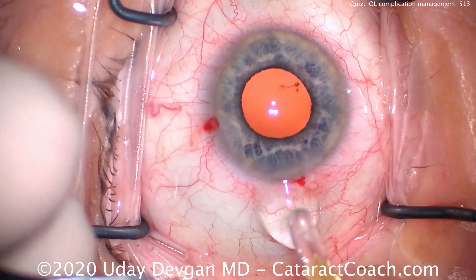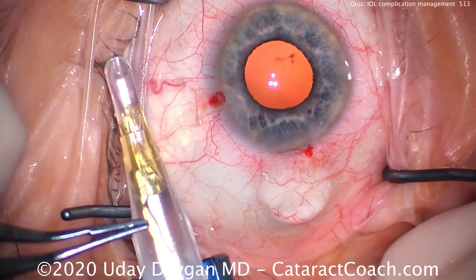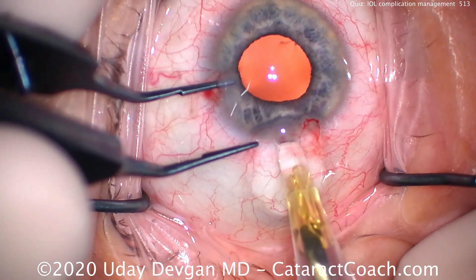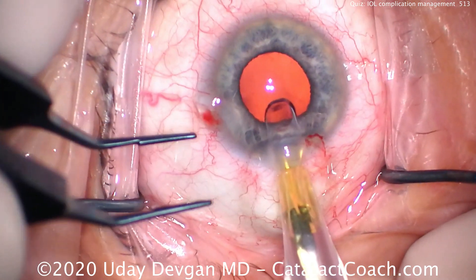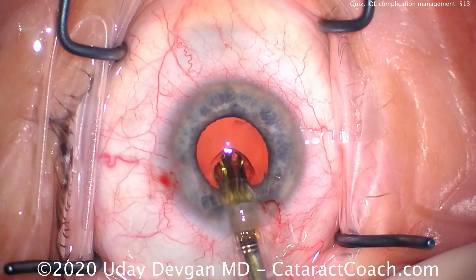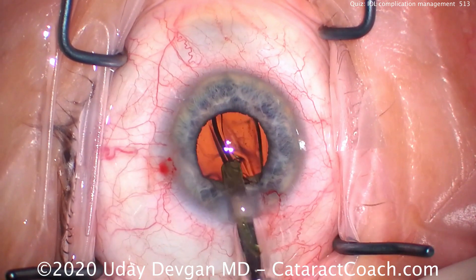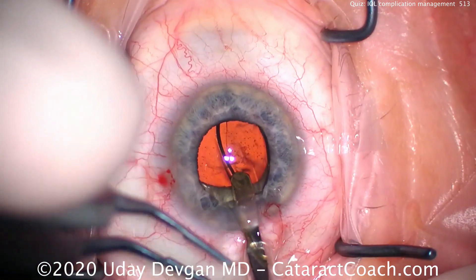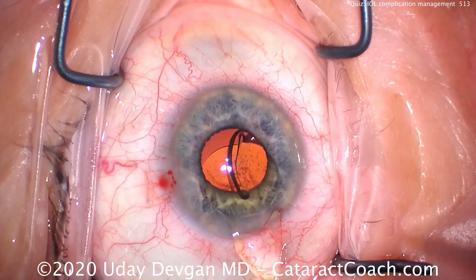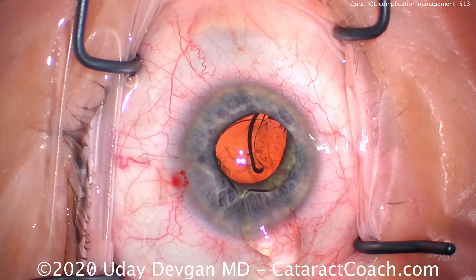We're going to zoom in and put the lens in. What instrument am I going to use to hold the paracentesis — the chopper as usual? No — I see that haptic right there, so I'm using forceps just to quickly hold here. I want the forceps ready in my other hand so that when I deliver this lens and that trailing haptic is stuck partly outside the eye, I can use those forceps to help bring that haptic in. Now I can grab that haptic — there it is — and get the lens inside the capsular bag. We want to be very careful not to damage that trailing haptic.